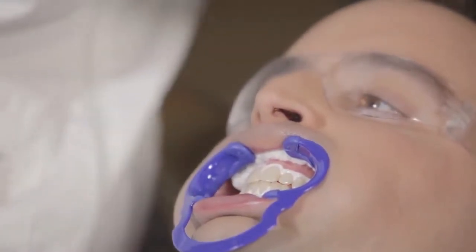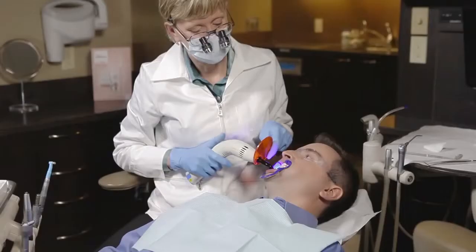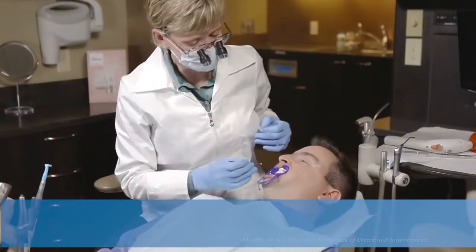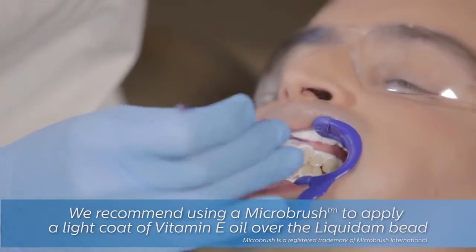Repeat the Liquidam application on the lower teeth as well and utilize the same curing method as before. Next, apply a light coat of vitamin E over the Liquidam, taking care to avoid getting the oil on the teeth.